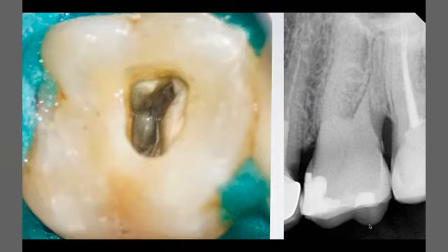You can see now I am reaching the dark dentine. I am reaching my floor map, and you can see I have already removed the calcification over the mesiobuccal canal. But I still have some white spots on the distobuccal orifice and also on the palatal side.